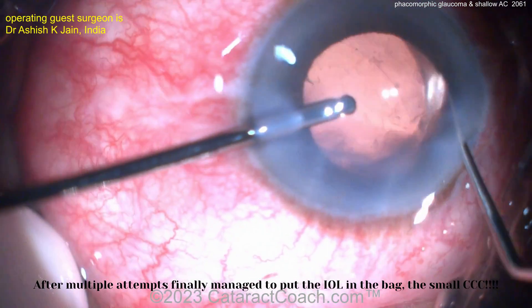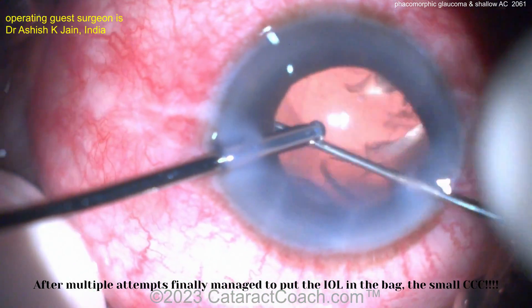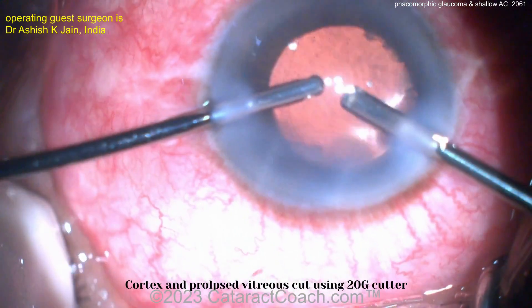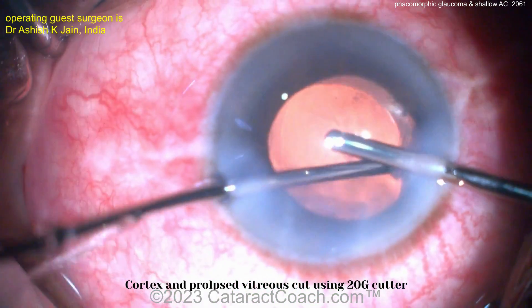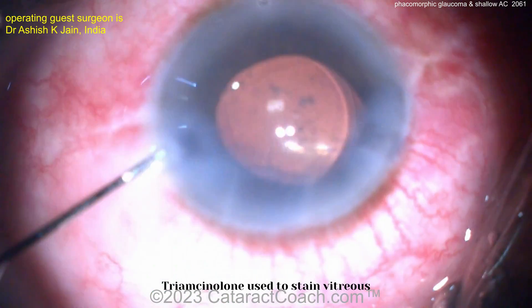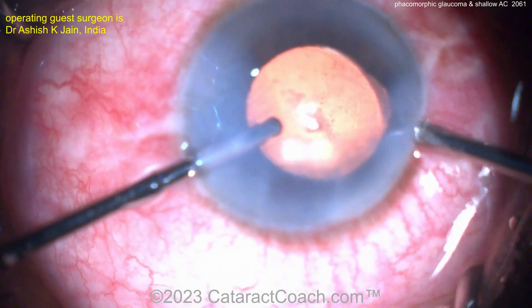A lot of times, patients with phacomorphic glaucoma can have very weak zonules. Now finally the lens gets into the capsular bag. Remember, that is definitely a small rhexis — that's the tough part with a small rhexis; it makes it very difficult to get the lens in if a haptic ends up in the sulcus. Now cleaning up a little bit of that lens material. The vitreous cutter is going in for the vitrectomy, and aspirating out a little bit of remaining lens cortex. In this case, you took out a crystalline lens — a cataract probably at least 5 millimeters thick — and replaced it with a man-made lens that's about a millimeter thin. That solves the issue of the closed angle and the glaucoma. Triamcinolone goes in the eye.